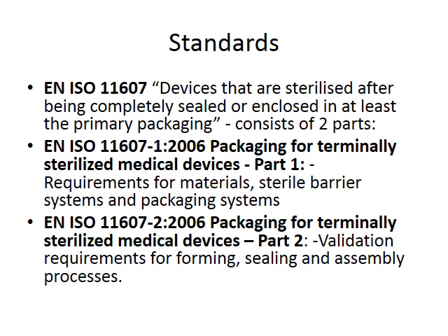And there are some standards governing packaging. For example, EN ISO 11607 is for devices that are sterilized after being completely sealed or enclosed in at least the primary packaging. So this standard relates to packaging for devices that are going on to be sterilized after packaging. Packaging for terminally sterilized medical devices part one is the requirements for the materials, the sterile barrier systems and the packaging systems. And part two is validation requirements for forming, sealing and assembly processes during packaging.